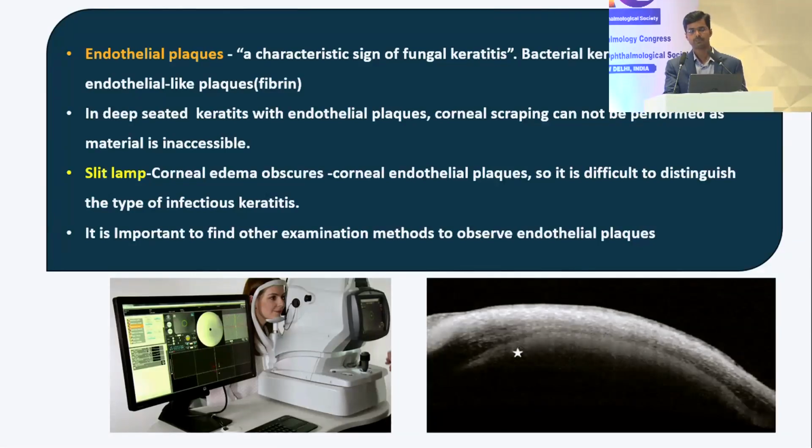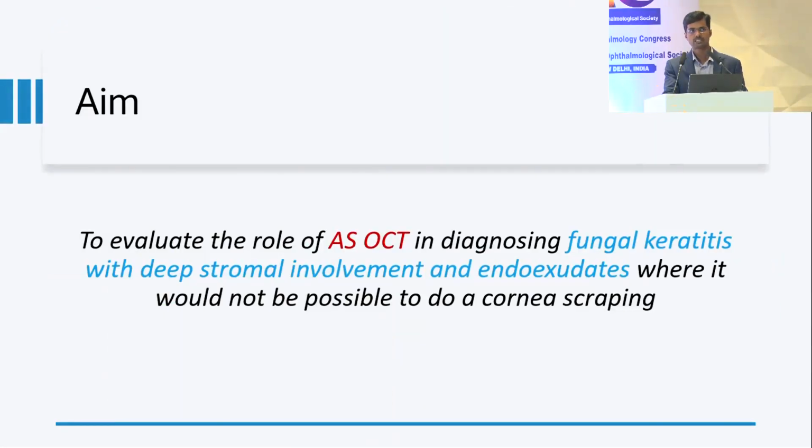On slit lamp, we can see the endothelial plaques, but we cannot differentiate whether it is bacterial or fungal, and it is difficult to delineate the margin between the endothelium and the endothelial plaques. So it is important to find other examination methods to evaluate these endothelial plaques. This is the background for my study.